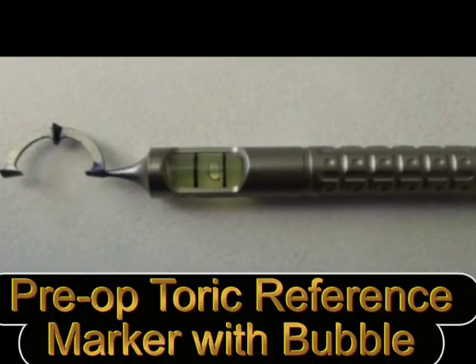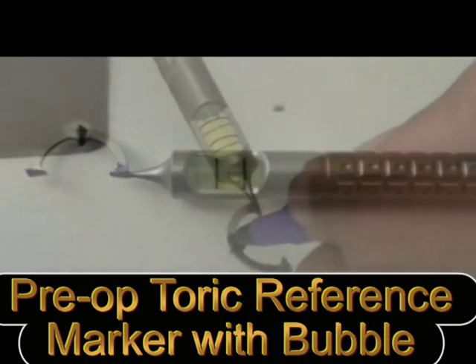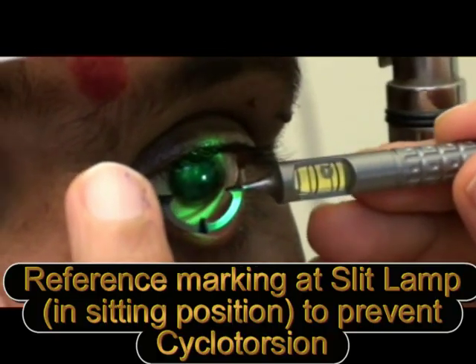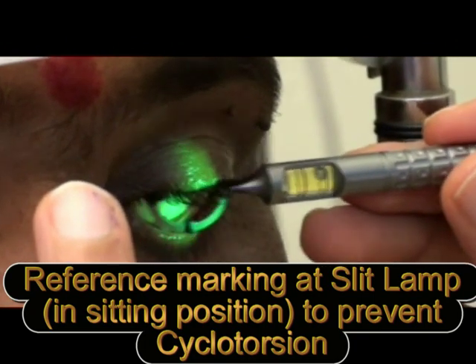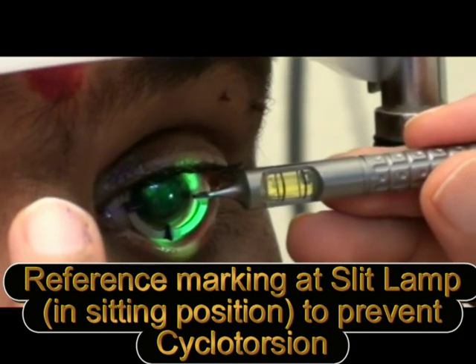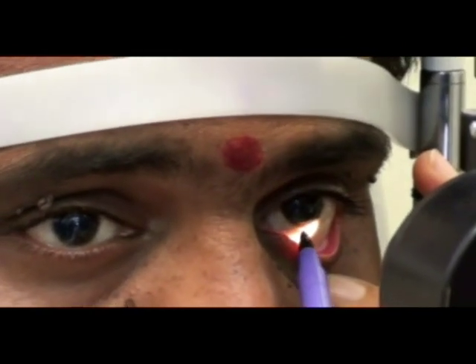This is the toric reference marker with a bubble — a special marker which has a spirit-level kind of air bubble inside to ensure that the reference marking is perfectly well aligned. The reference marking is done usually on the slit lamp with the patient in a seated position. The marks are placed using a marking pen and the air bubble has to be exactly in the middle of the two lines. With the bubble in the center, the reference marks are put on the cornea.